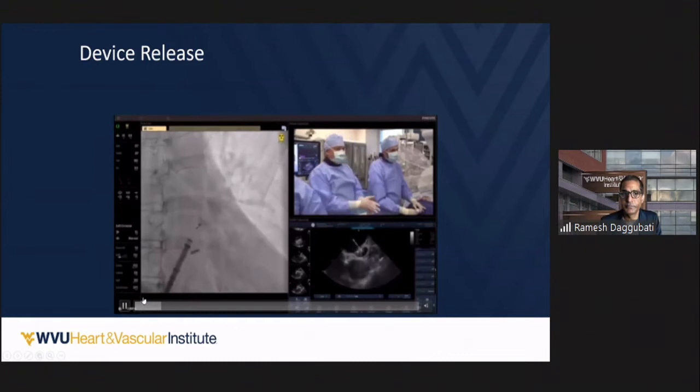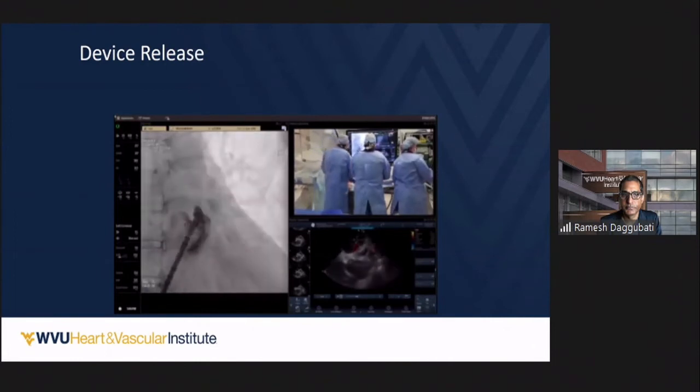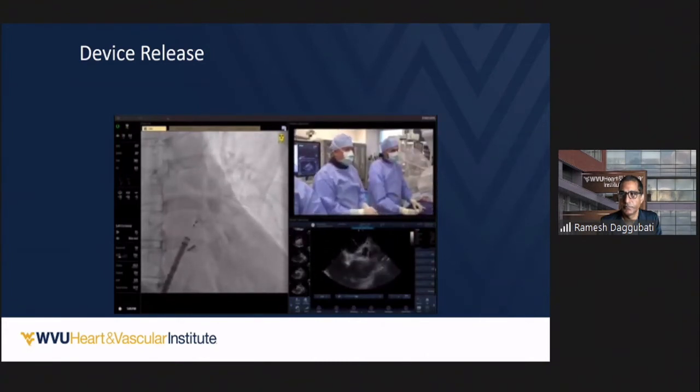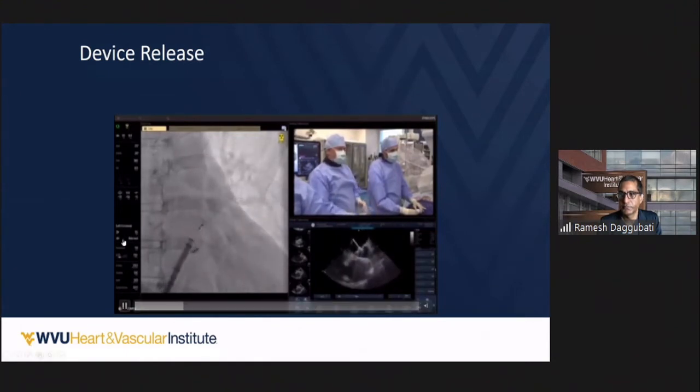Pull this 135 maybe. Go ahead and measure the compression and the color sweep. So we're happy we meet the modified pass criteria for ICE. Go ahead and release this. So this is the last view I'm going to give you. Pull this 135 maybe. Go ahead and measure the compression and the color.